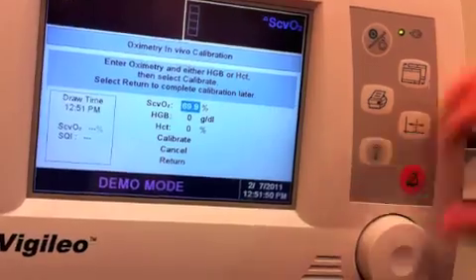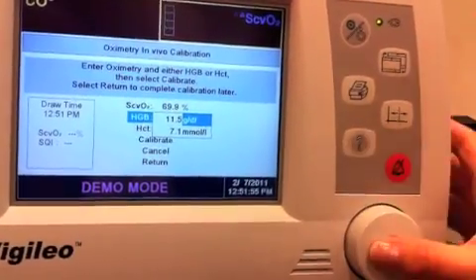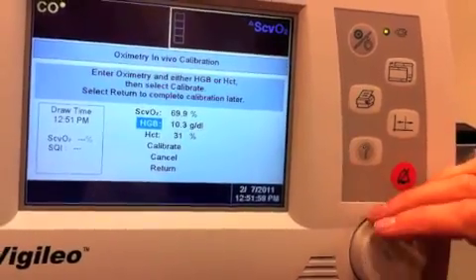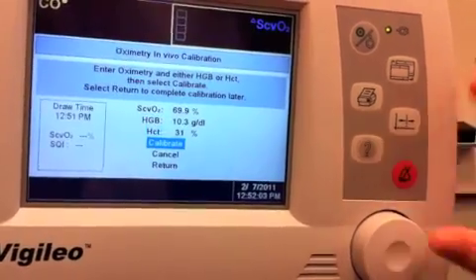Enter their hemoglobin — 10.3 — and a hematocrit of 31. Then you'll select calibrate.